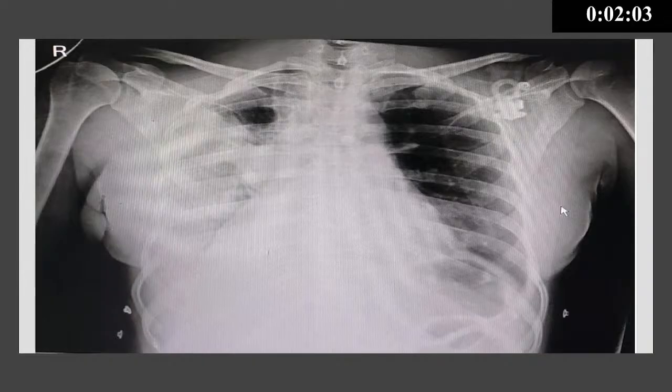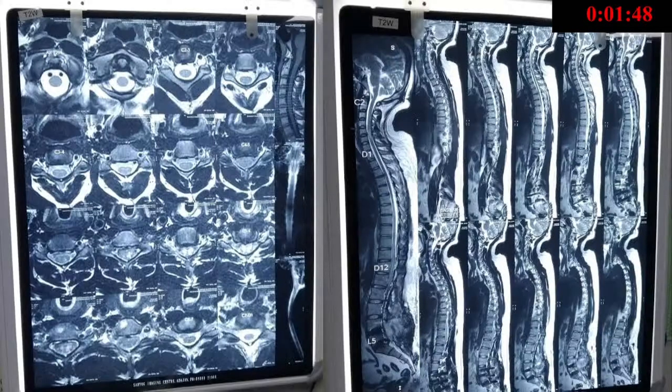Why did this happen? This happened because one of the new floor technicians who had joined, I had asked him to give 2 puffs at one particular point of surgery. So he made it as a life's mission that throughout the surgery I have to do that, and unfortunately that got missed out. So because of that, the patient landed up with this kind of a picture. Fortunately, this was recognized. We were able to manage it.